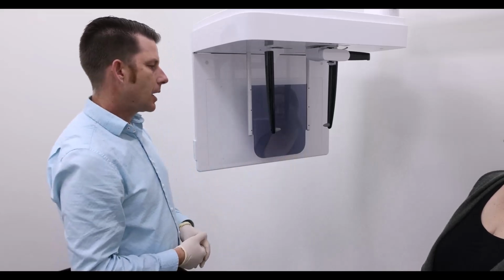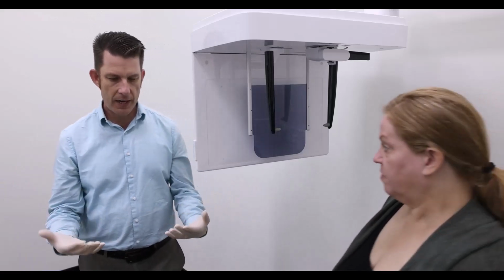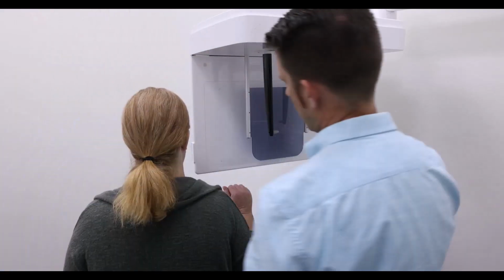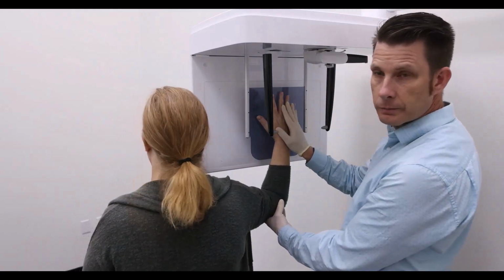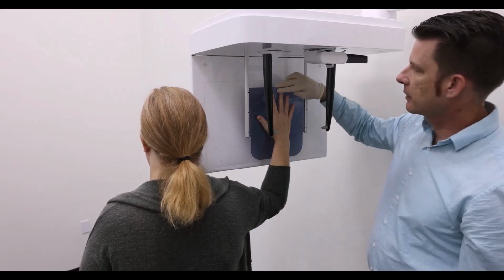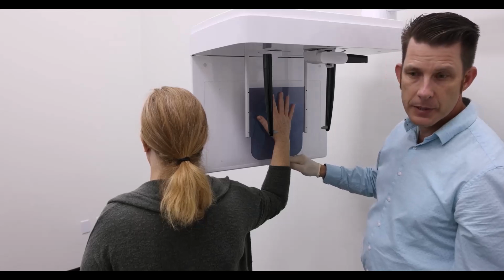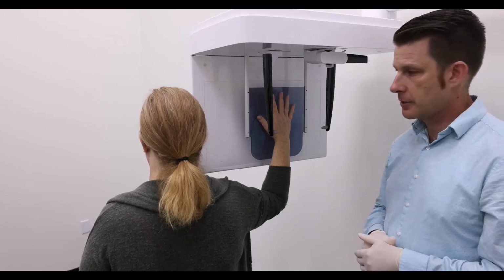I'm going to have my patient come and stand basically facing me. So if you want to go ahead and stand and face right here. Our patient is going to go ahead and raise your arm. Let me get it around the side. We're going to have our patient raise their arm and place it flat on our Carpus plate right here. Note that my fingertips are below the top of the Carpus plate and the wrist is above the base of the Carpus plate. Next, I'm going to step out of the way and take our image.